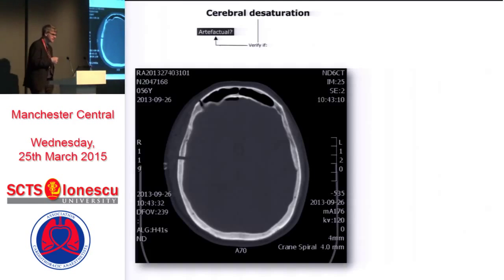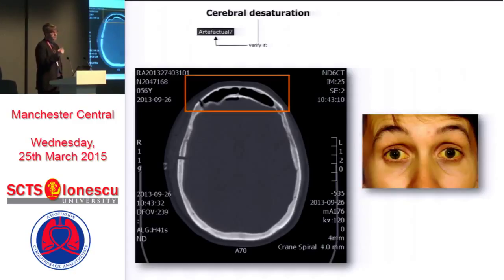So the first step when you have a brain desaturation, I would say, especially if you start with a low value, is to make sure it's not an artifact. We've seen this in patients, especially who have a very high frontal sinus. But this happens maybe in 1 out of 200 patients. It's very rare, but these patients are fine and they have a saturation of 22% to start with. So when you start with a low value, you have to question, is it truly a low value? But the majority of the time, if the patient is fine, it's just an artifact. The other common situation in which we've seen low values is hyperbilirubinemia, because hyperbilirubinemia will absorb infrared and then will give you very low values. So these are the 2 most common situations in which it's hard to interpret, especially a baseline value of NIRS.